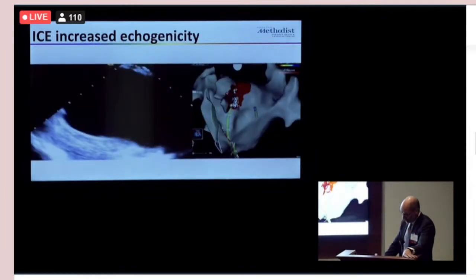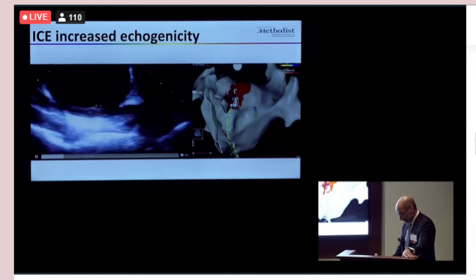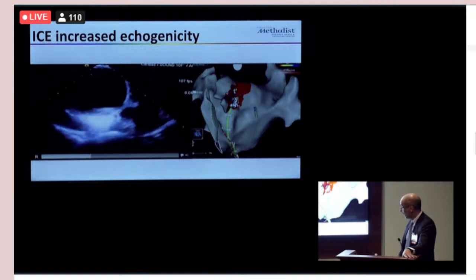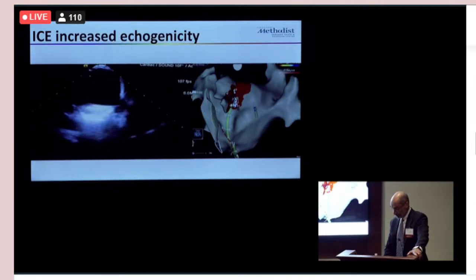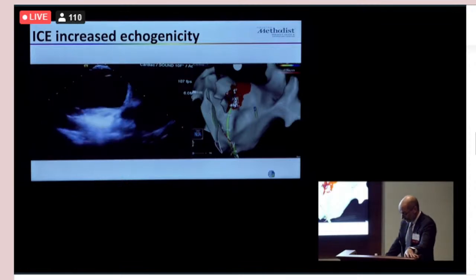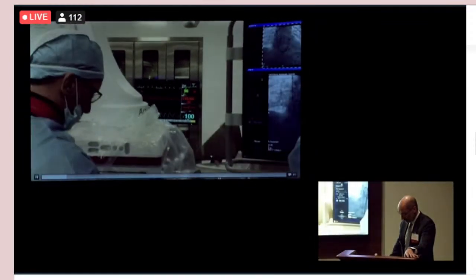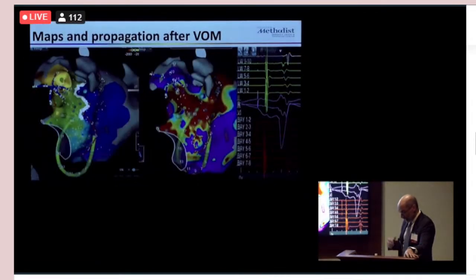And once we do that, I like to monitor on ICE the effect of ablation. You will see on ICE this tremendously echogenic area here, right where you would expect it below the left inferior pulmonary vein. If you use CartoSound, you can actually outline it, and it will show you where this bright echogenic area is, which is right on the left atrial ridge in the mitral isthmus. Once we have that, I like to go back with the 2 French catheter, and I like to reconstruct.